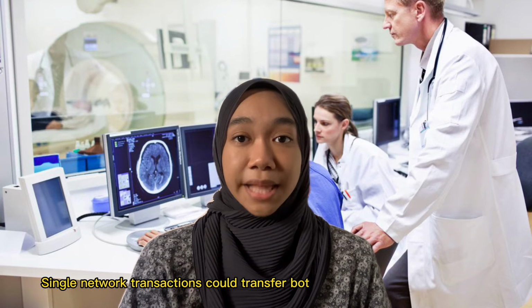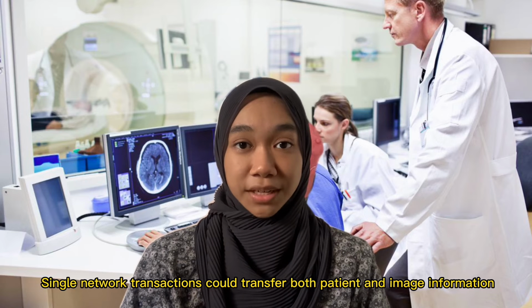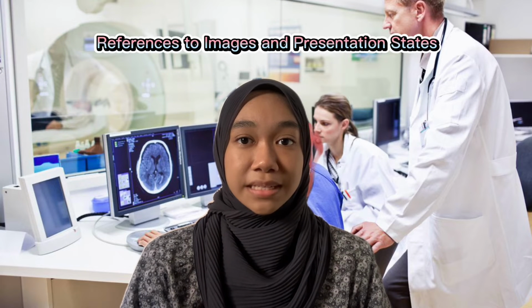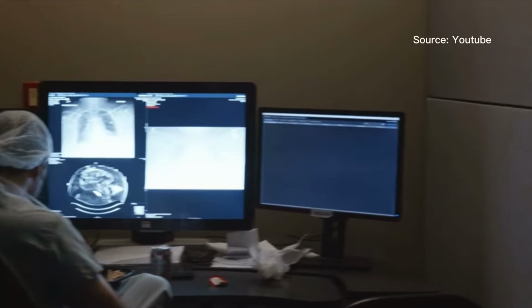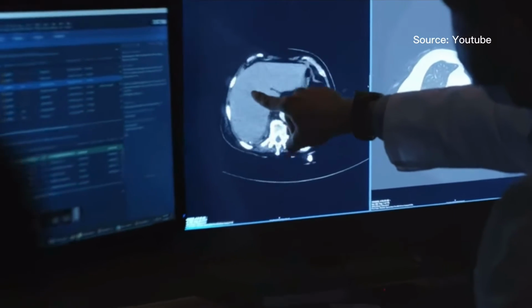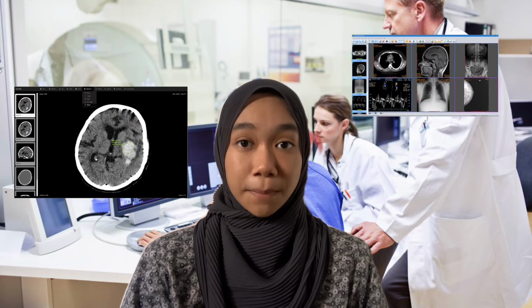Additionally, single network transactions could transfer both patient and image information. Lastly, references to images and presentation states. Images can be referenced inside the document by including their Universal Unique Identifier (UID) in a note. Moreover, semantics associated with the reference object convey the purpose of the reference. Image frame numbers can also be specified to reference explicit frames within a multi-frame image.